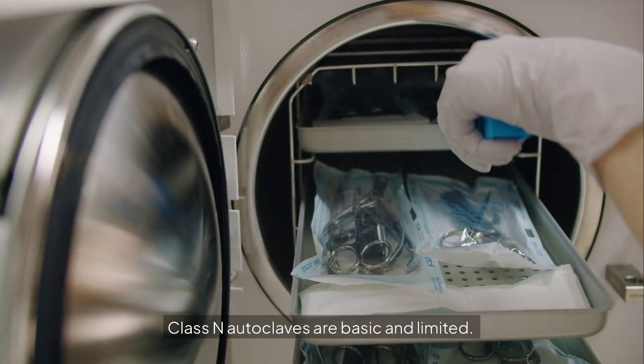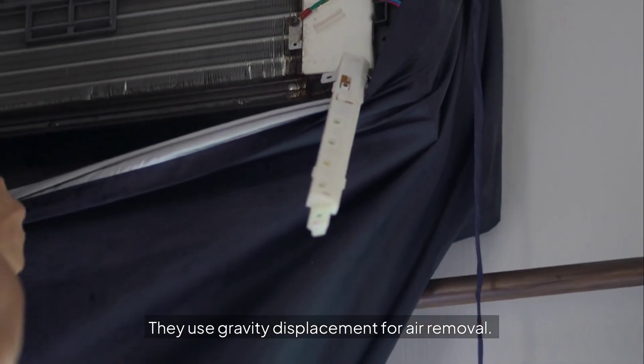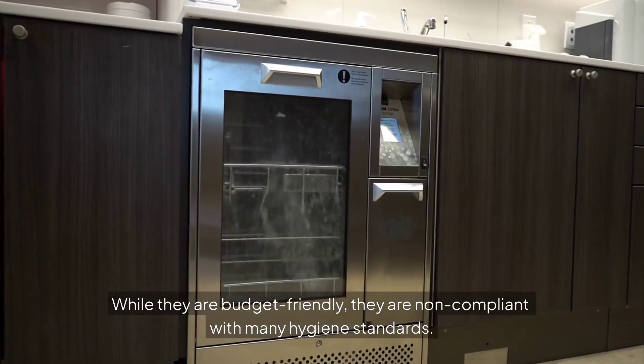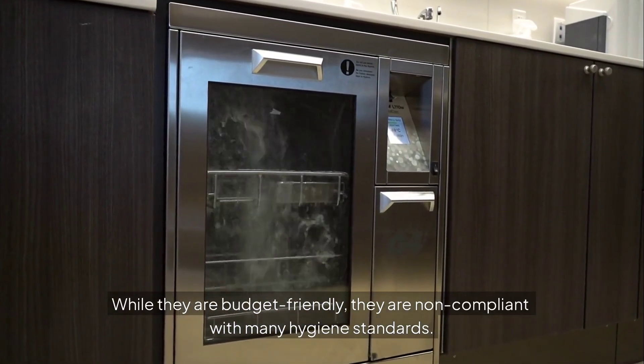Class N autoclaves are basic and limited. They use gravity displacement for air removal and can only sterilize solid, unwrapped instruments. While they are budget-friendly, they are non-compliant with many hygiene standards.